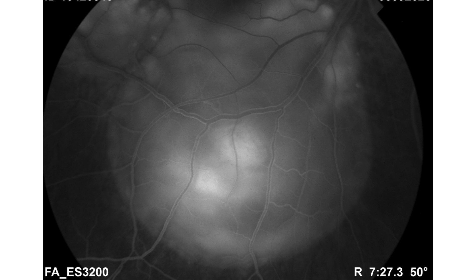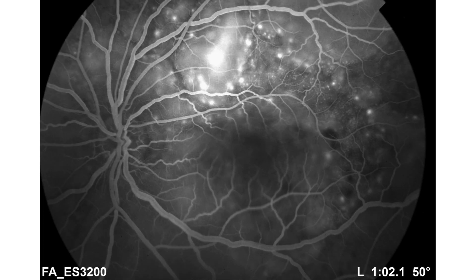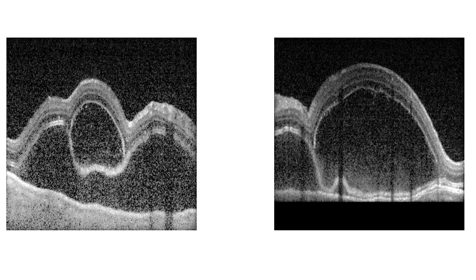When these focal leakage areas join together, they attain the shape of a bullous localized serous detachment. This is beautifully shown in this fluorescein angiography image. Again, focal multifocal leakage areas — which ultimately led to the previous slide findings — showing hyperfluorescent areas. We also did the OCT, and in OCT we can see that the RPE is having folds.